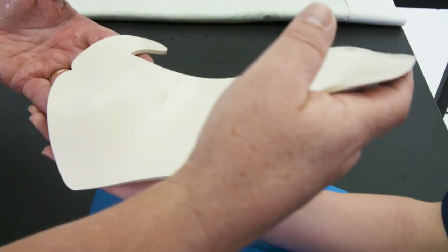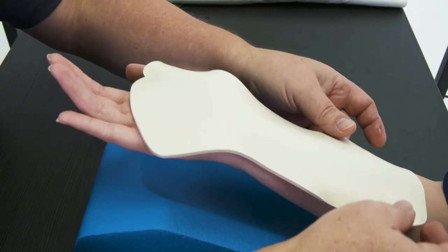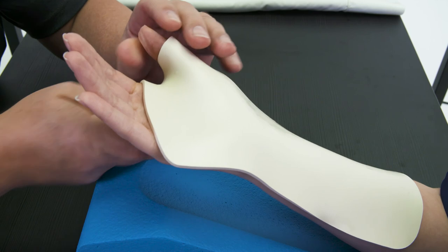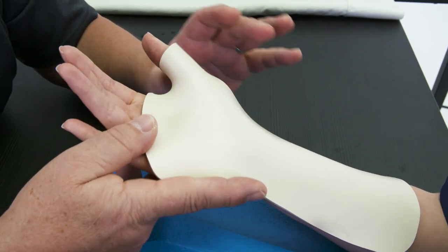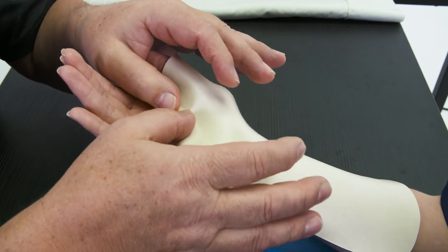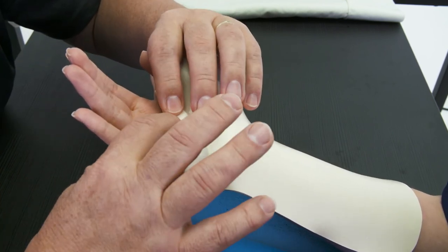Cradle it with both hands and place the pre-cut in the same position as during the assessment phase. Use your thumb to gently draw the thumb web space notch into the patient's thumb web space. Fold the distal end of the pre-cut approximately ¼ inch proximal to the distal palmar crease. Use your hands to form the transverse metacarpal arch.